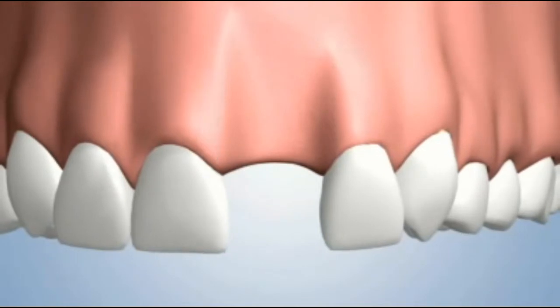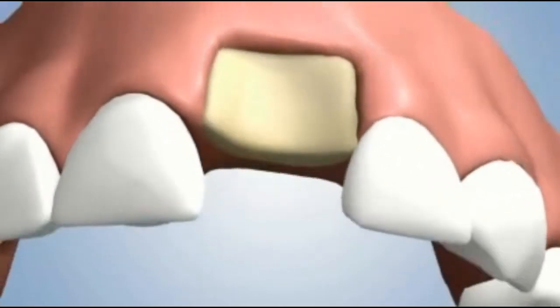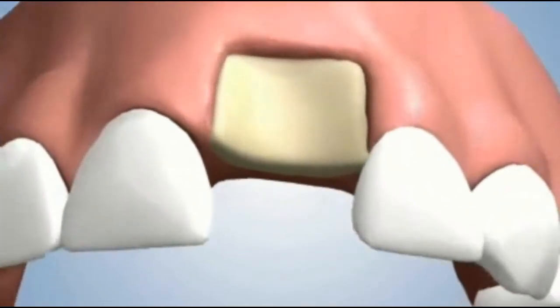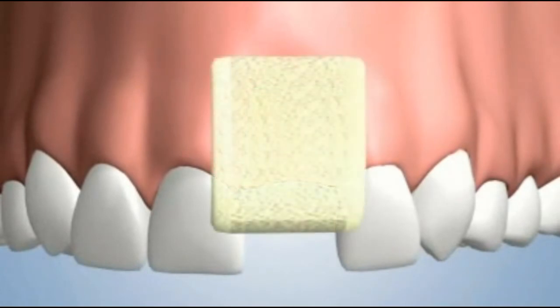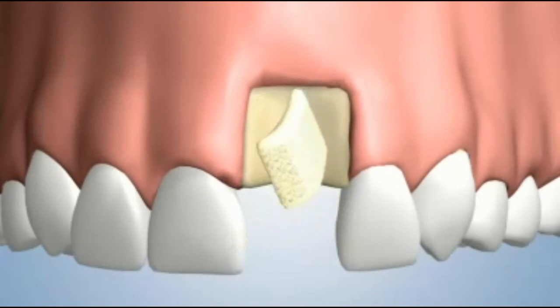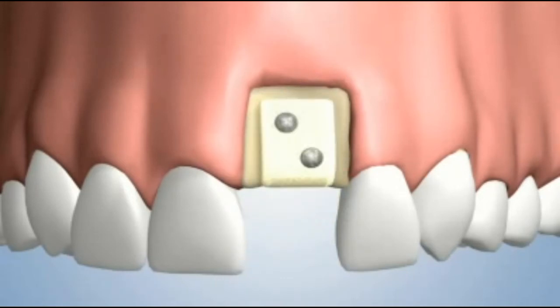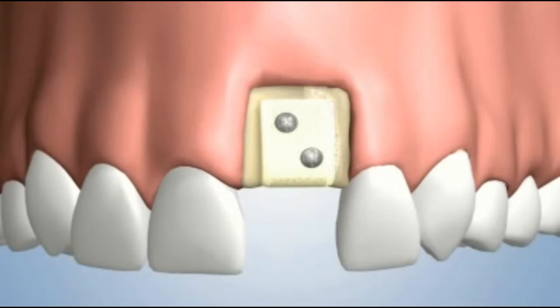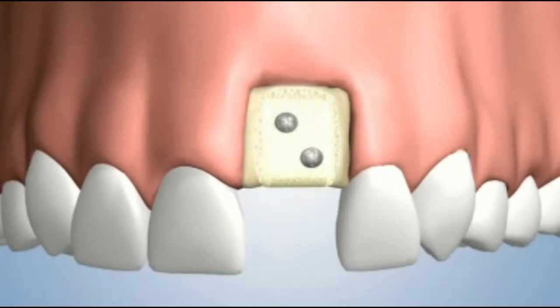To rebuild the bone, we must first access the area beneath the gums. A small block of substitute bone is shaped to restore the ridge to its original form prior to bone loss. The block is secured in place and the surrounding area is covered with additional bone product to help create a more natural shape.